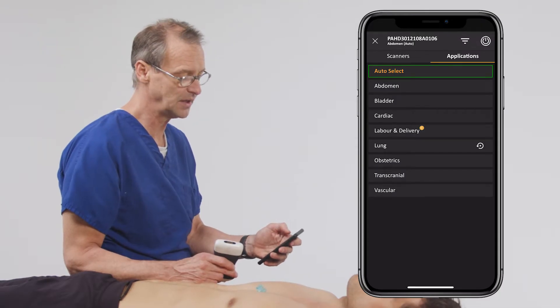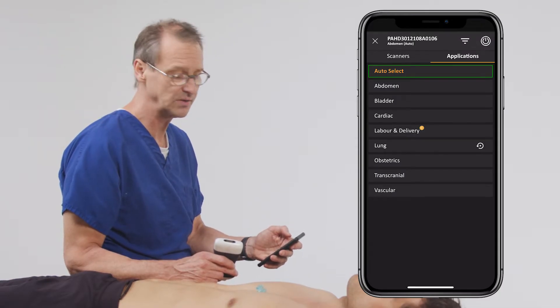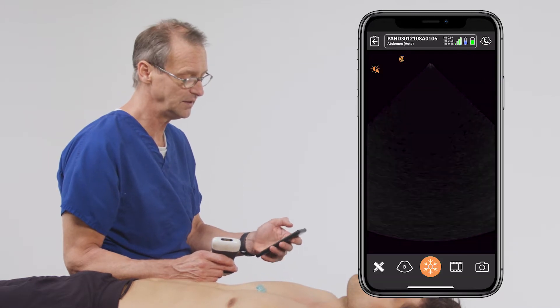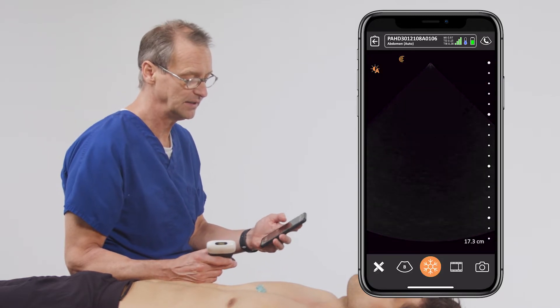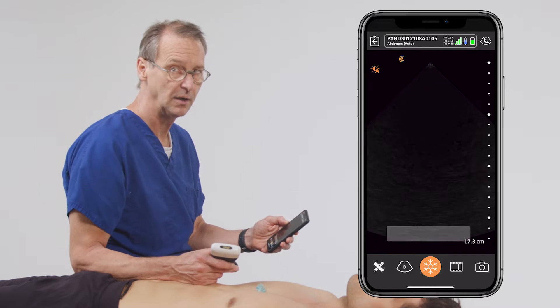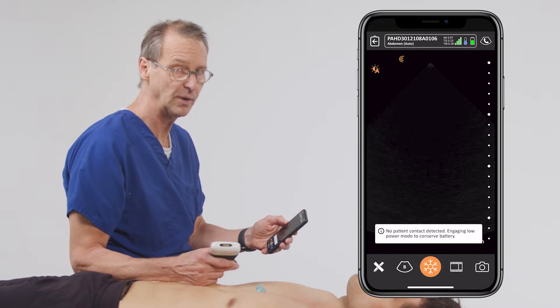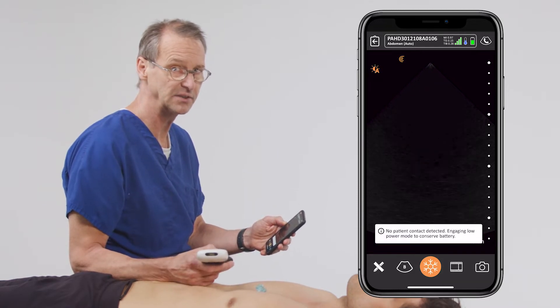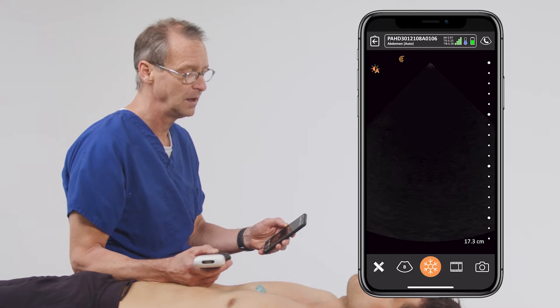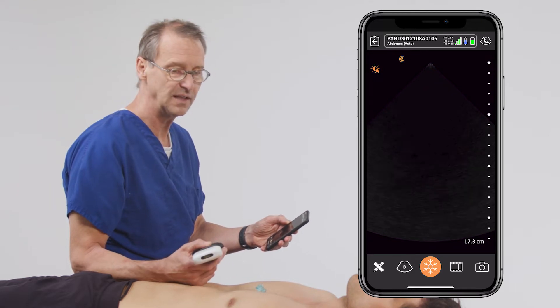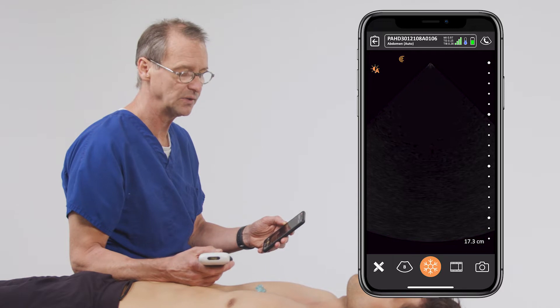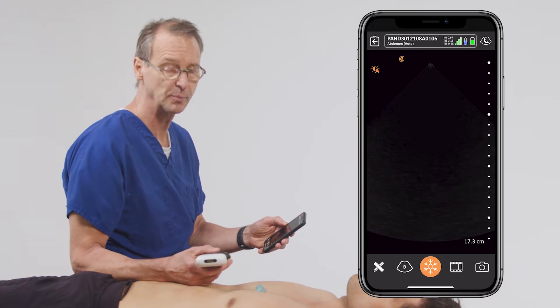To start the exam, I'm going to select the auto-select application. What this does is it allows me to examine many different areas of the body without having to go back to my preset selection and choose a different option. It makes the exam much easier to perform and you can also accomplish it in a shorter period of time.